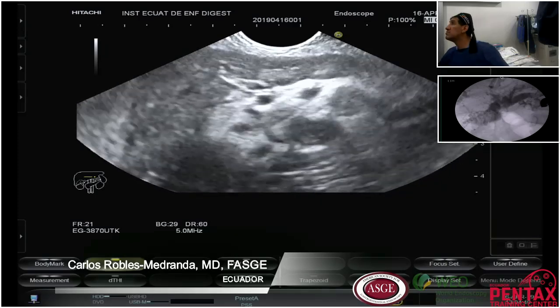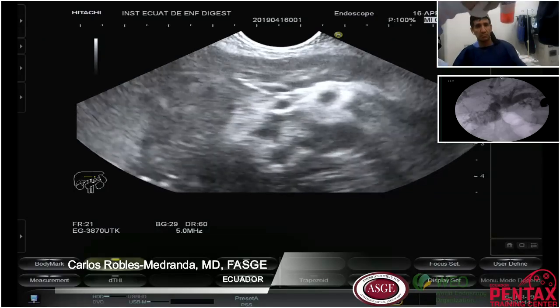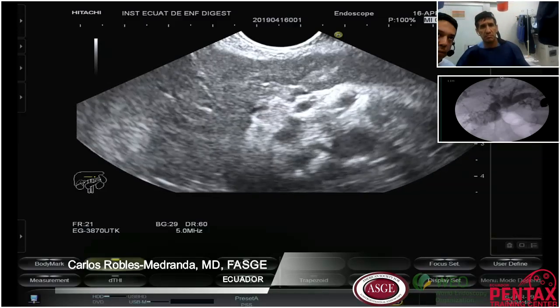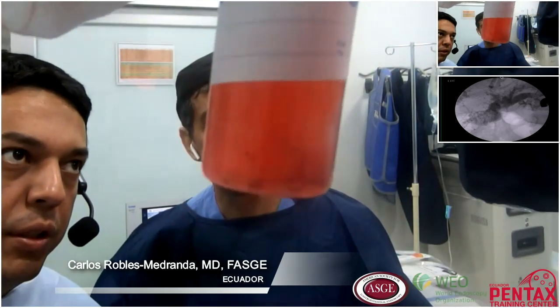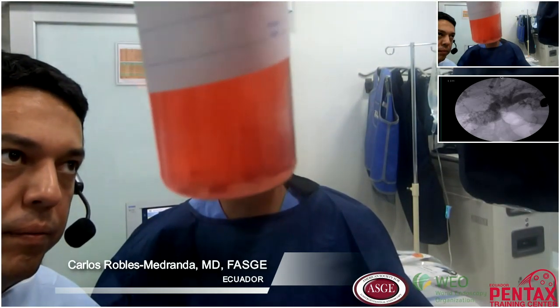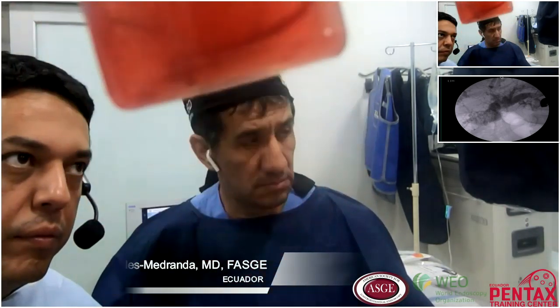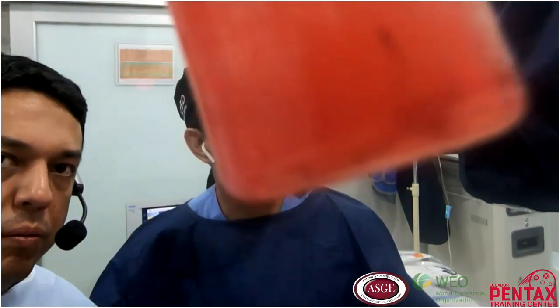So, I think we have a very good tissue. Puedes poner la cámara principal. We have a very good tissue. You see here. So it's a very good tissue.